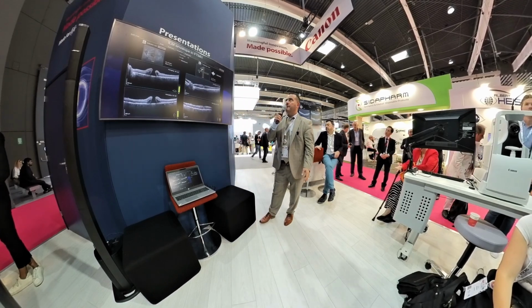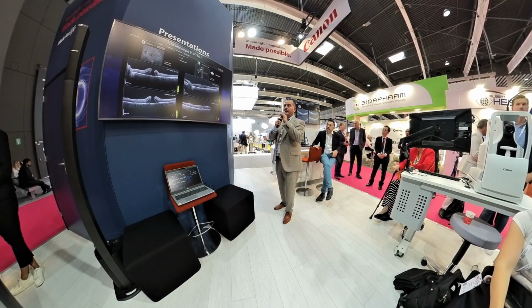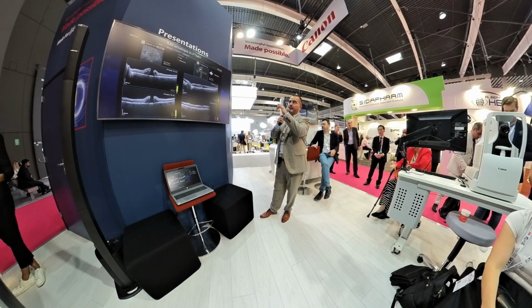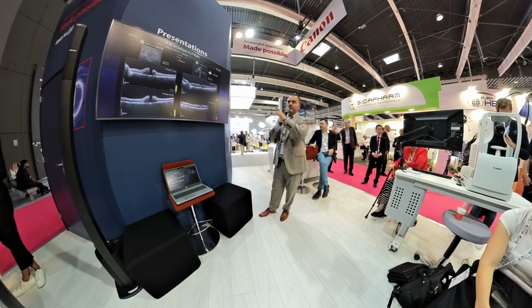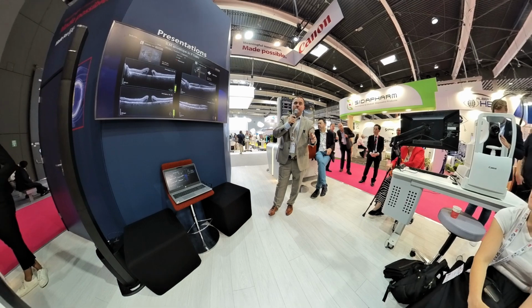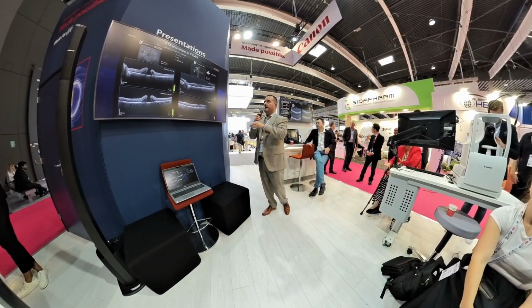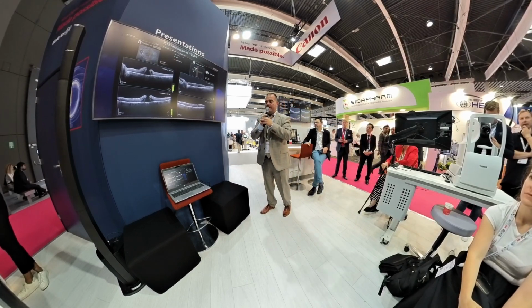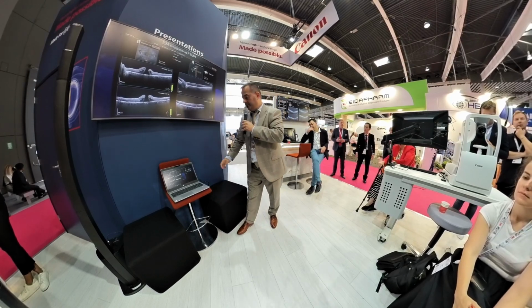This is a case of the ILM envelope technique where we are using heavy silicone tamponade, and this is a re-operation of an unsuccessful closure of a huge macular hole. So in order to be sure, we use the envelope with heavy silicone. And again, the higher resolution images are quite useful for us in order to even predict the prognosis of the patient.